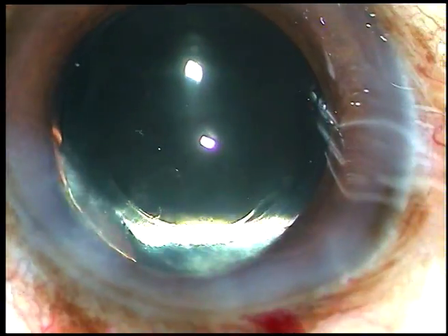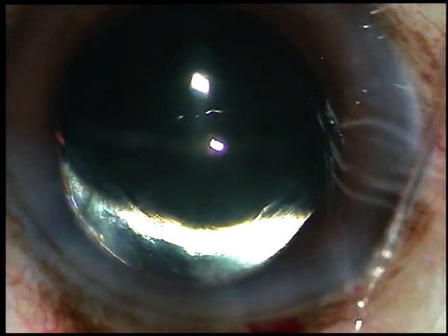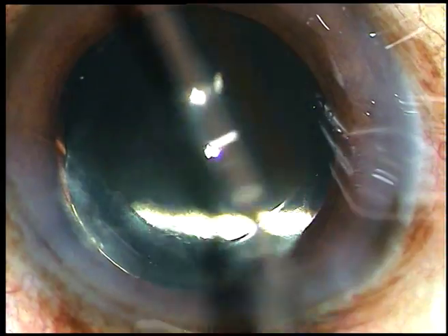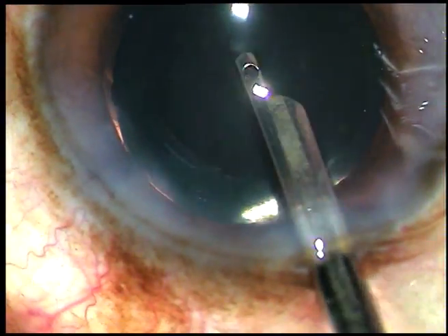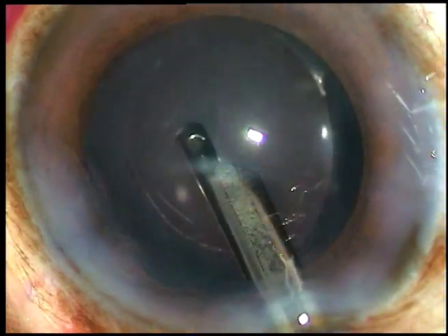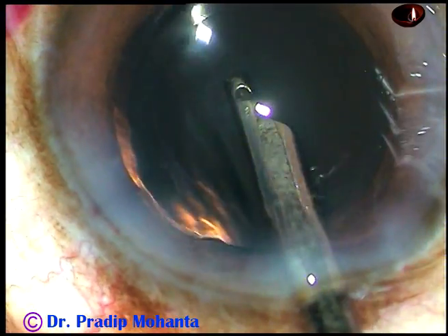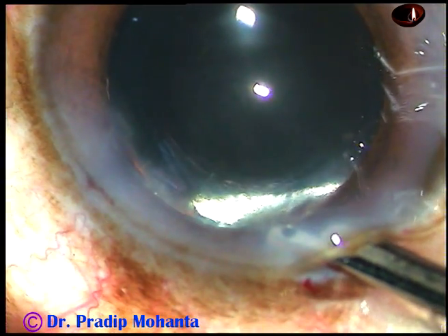Now after injecting a bit of moxifloxacin, the side ports are hydrated and then the final lavage of the anterior chamber is carried out. This is very important to get a quiet anterior chamber the next day. The anterior chamber is nicely formed and the case is concluded.